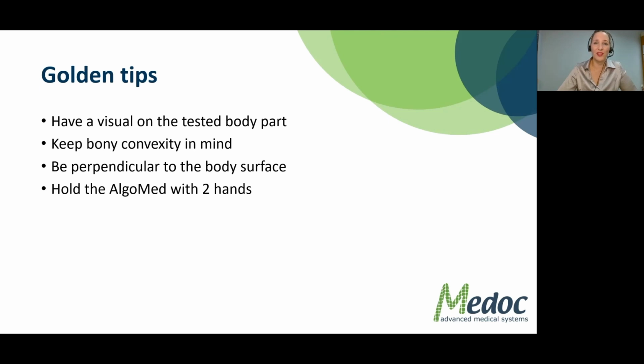By the way, there has been an interesting study where they used the AlgoMed to test skin flap techniques at the donor side, and to see whether the healing of a specific skin surgical technique was better than another surgical technique. So in this case, they did want to look at scar tissue. Another thing that can happen is that your subject went to the beach yesterday and got a sunburn. You're not seeing this because they have a shirt on, but if they remove their shirt, you can see that the skin is sunburned.